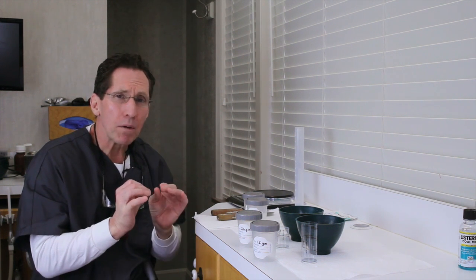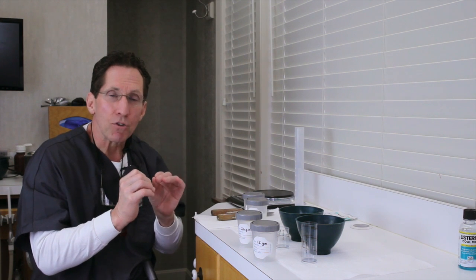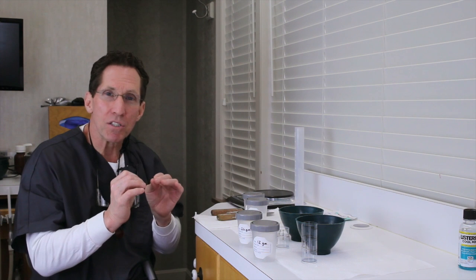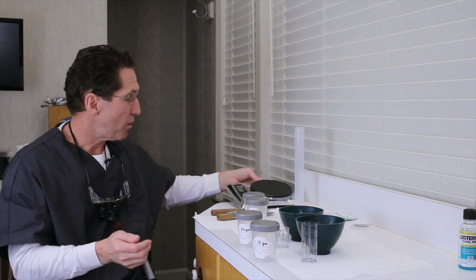And remember, the important part about the water-powder ratio is strictly, from our standpoint, to control the viscosities that we want to achieve. Viscosities that allow us to get really good impressions of the occlusal tables and the interproximal portions of the teeth, and to get very nice border molding and border extensions for the soft tissue areas. Now, how do we do that? Well, again, I'd recommend these.